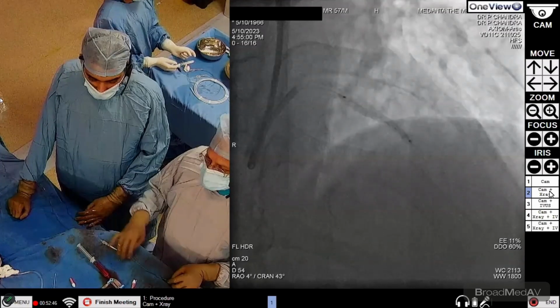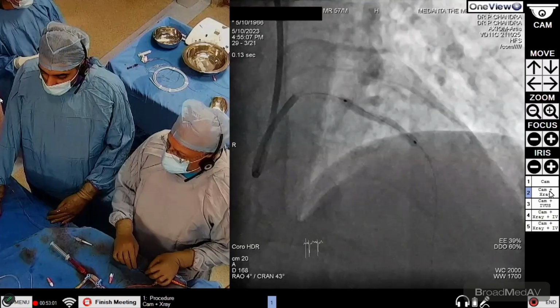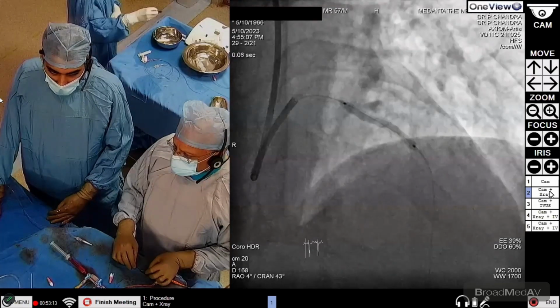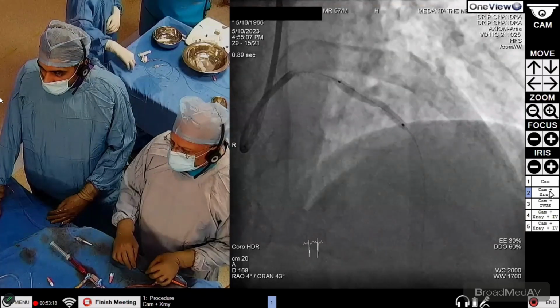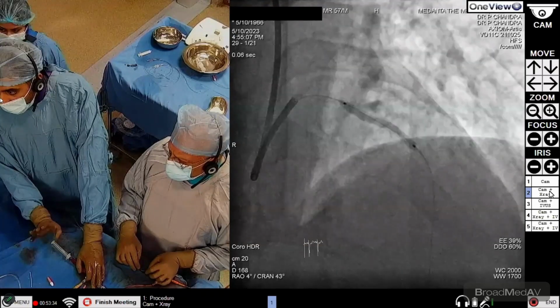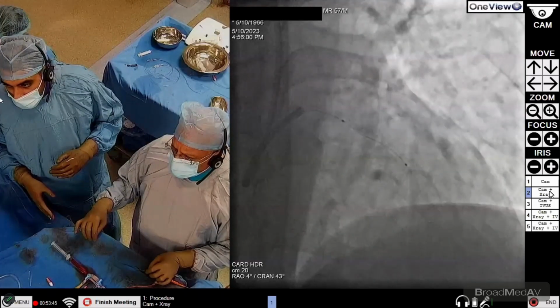Okay, and you can see that the dilatation of the balloon is complete. There is no residual anywhere, which means that the lesion has been fully treated. It's 1 minute now, and we will continue for another 30 seconds if he tolerates. Just 30 seconds. He is having some chest discomfort, which is natural, but typically this is 1 minute 30 seconds. Deflate. So we are deflating it now because he can't tolerate anymore. Otherwise, I could have gone a little bit more.